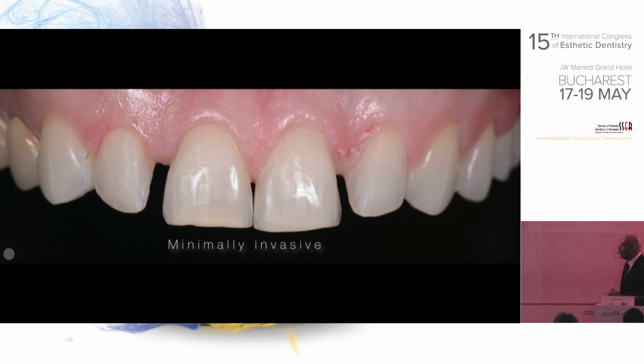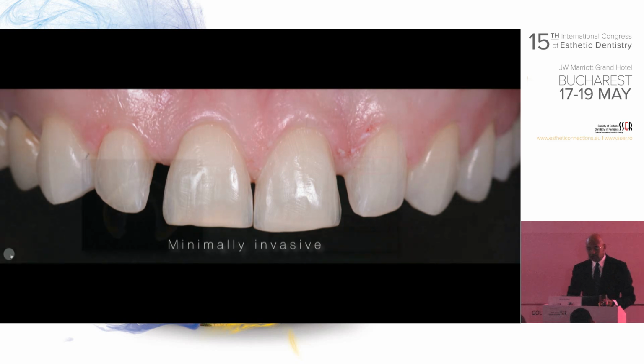So that means in the next 10 to 12 years, a veneer out of 3 will have a problem for sure. Either micro leakage or debonding, whatever. So our aim is always to keep this preparation on the enamel.